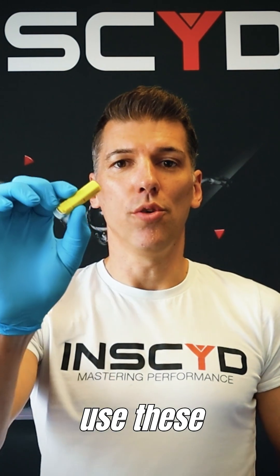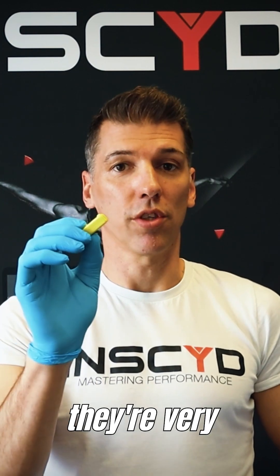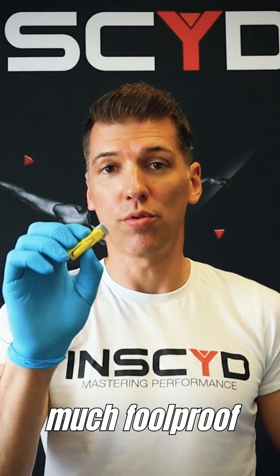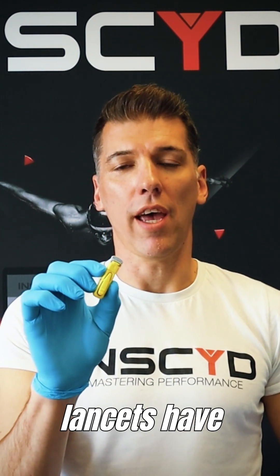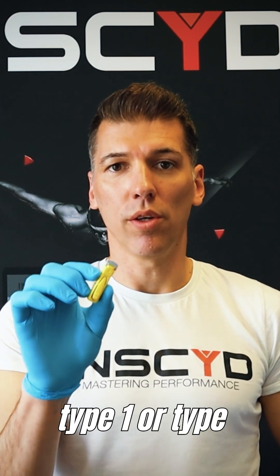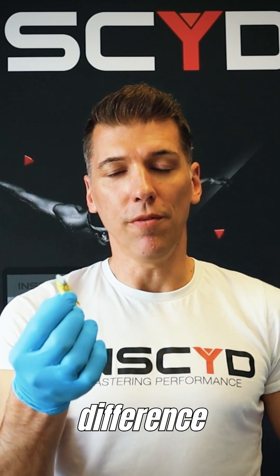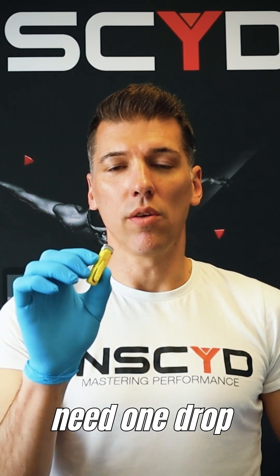The next piece of your kit for lactate testing is lancet sets. Most people use these automatic security lancet sets, which are great in terms of being very secure and pretty much foolproof to use. The downside is that those lancet sets have been developed primarily with glucose testing in mind — for people with type 1 or type 2 diabetes — where you normally only need one drop of blood for a single sample.